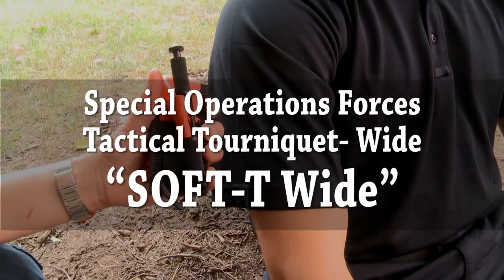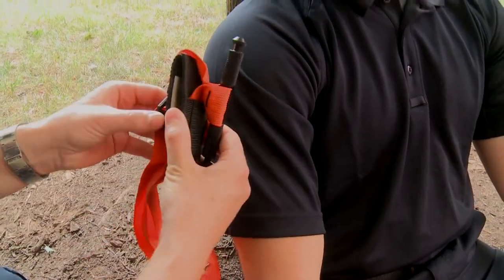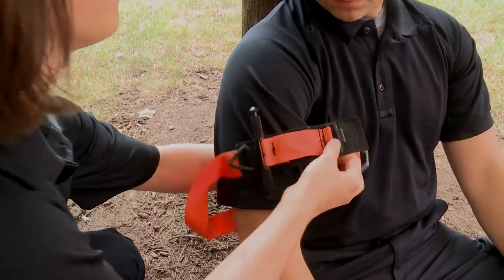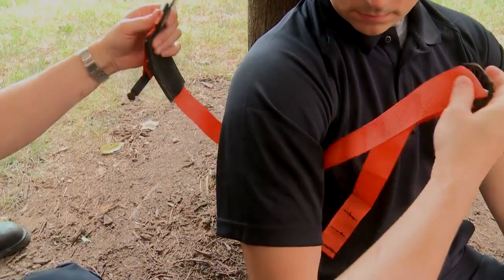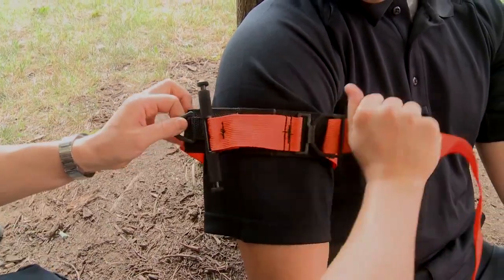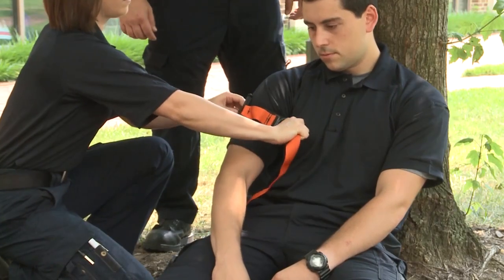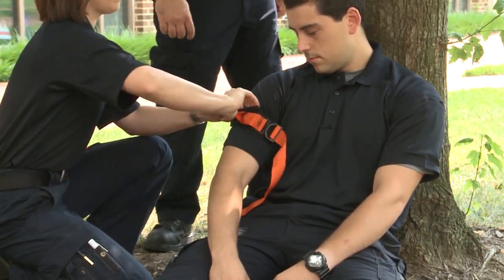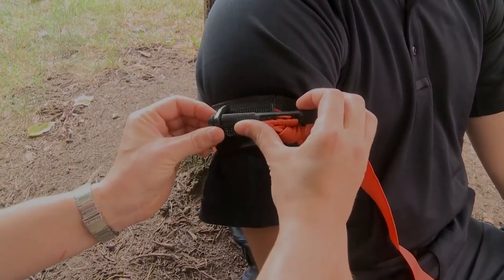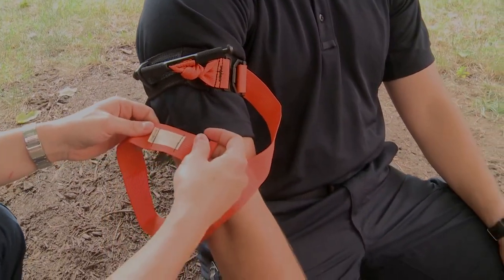The Special Operations Forces Tactical Tourniquet Wide, or the Soft T-Wide. To apply, first remove the quick connect buckle from the tourniquet platform and loop it around the extremity. Hold the tourniquet platform and pull on the strap as tightly as possible to remove as much slack as possible. Twist the tourniquet handle until all blood stops flowing from the wound. Secure the tourniquet handle into the tri-ring. On the end of the strap, record the date and time the tourniquet was applied.